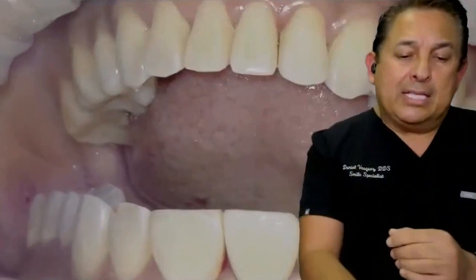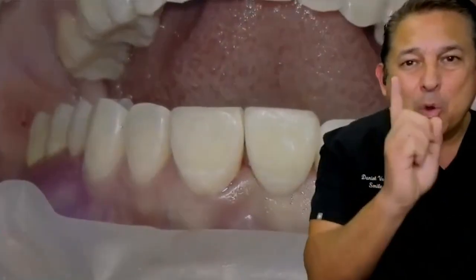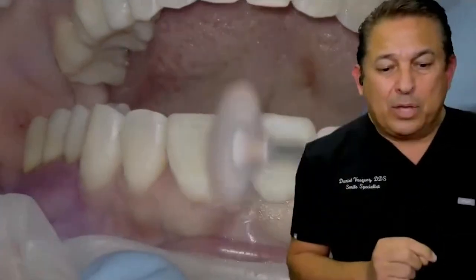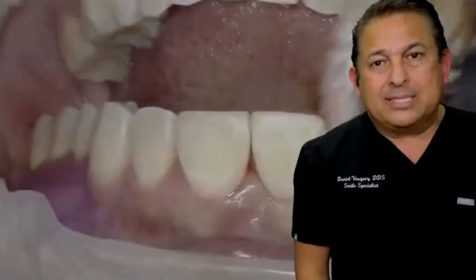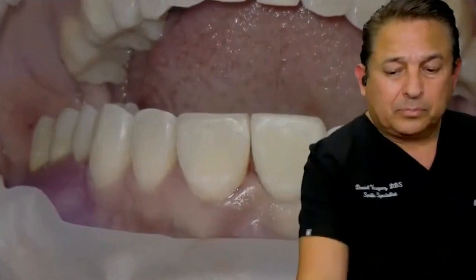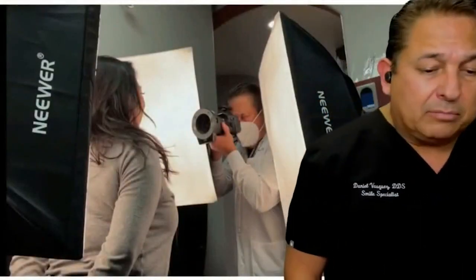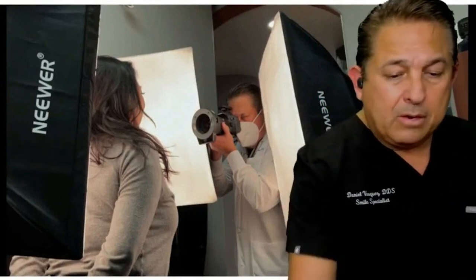And this is not a temporary crown. This is a customized healing abutment that we're controlling the emergence profile since day one, okay? So look at that. Look at the tissue. The tissue looks gorgeous. It looks beautiful. Once we do that, definitely let's get some pictures on her, okay? We can get some pictures.